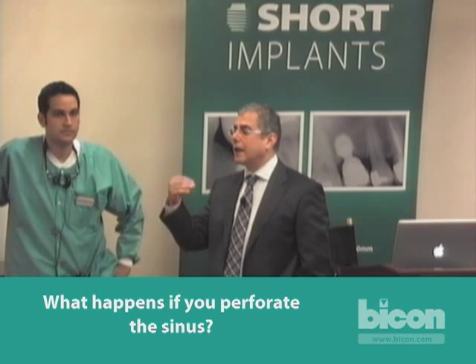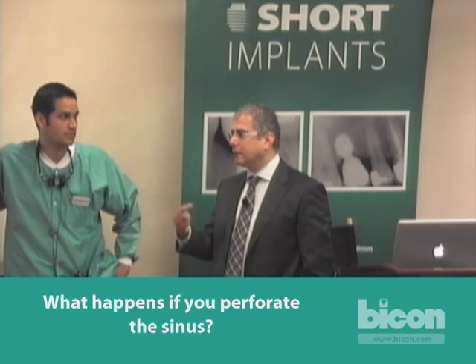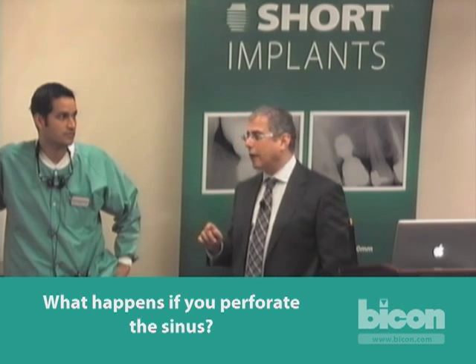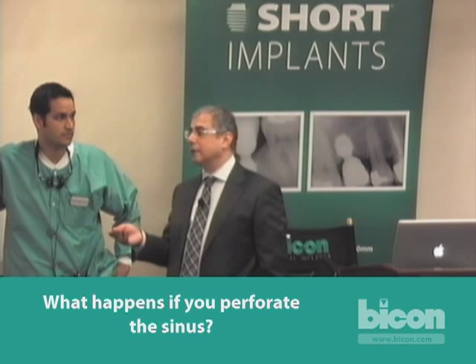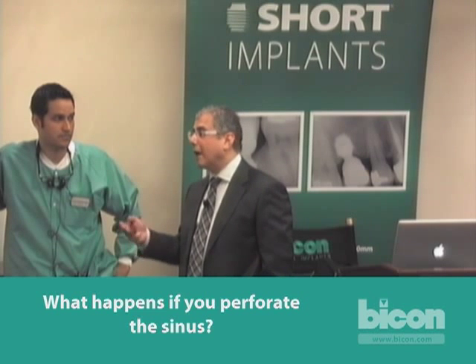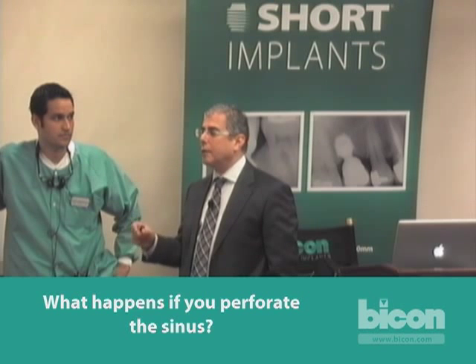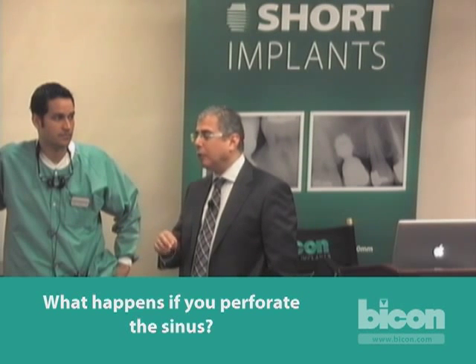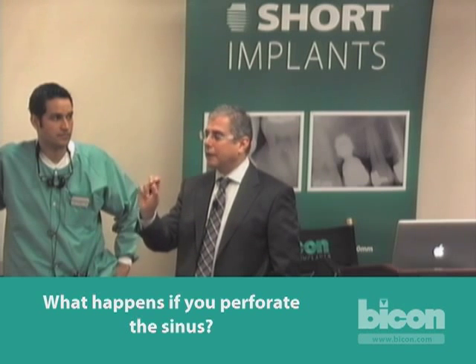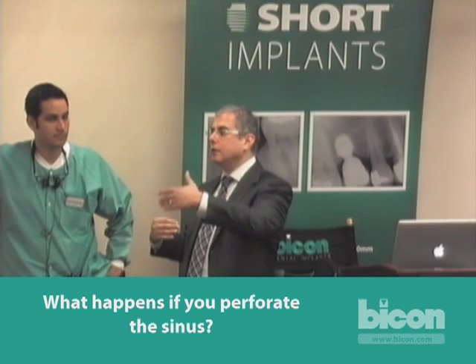Once you've recognized a perforation, take out anything you have in the socket — graft and otherwise. Cut a resorbable containment membrane, such as a collagen tape or a resorbable collagen barrier membrane. Cut it three to four times the size of your osteotomy, moisten it so it's very pliable, introduce it in the osteotomy, then introduce your graft in it, then introduce your implant in the graft — it's a layered approach. You want it big enough that it's still touching the sides of the osteotomy, and you secure your implant and membrane together that way.